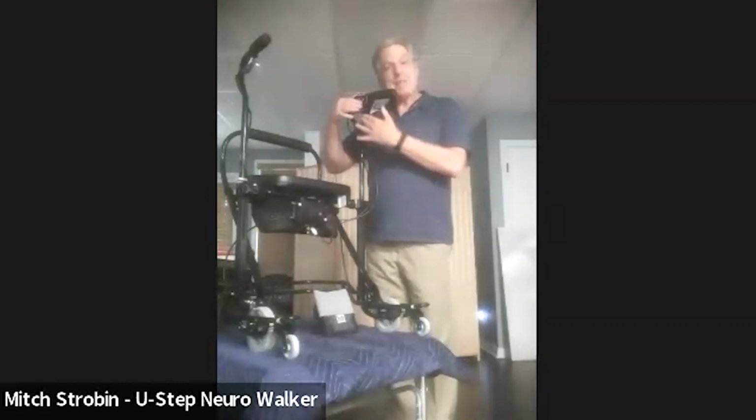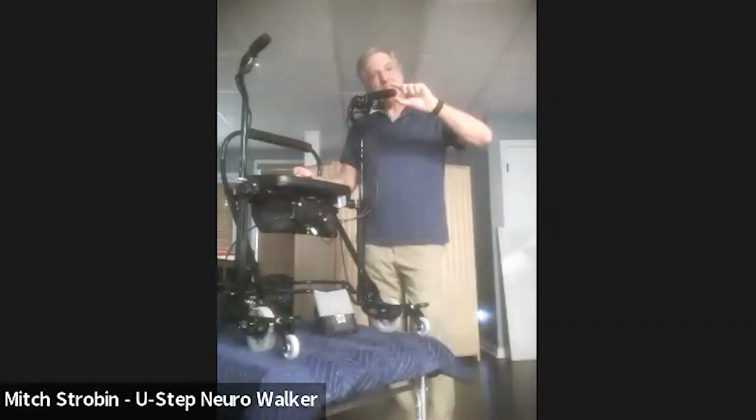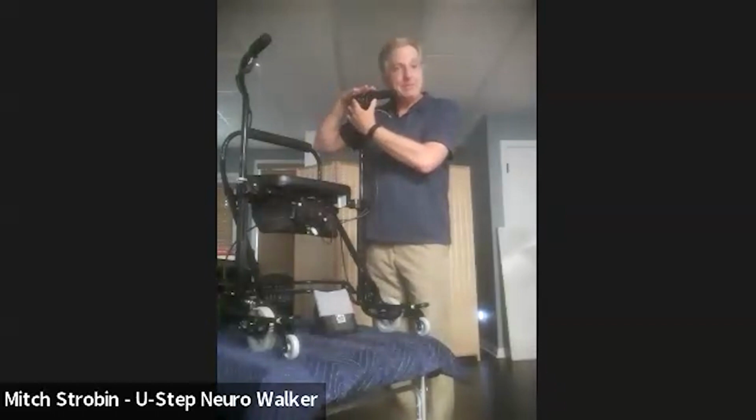Just to get technical, it ranges from 59 beats per minute, or about 1 per second, to 130 beats per minute, which is about 2 beats per second. Those 2 black buttons we had just talked about, when the metronome is on, you can increase or decrease the cadence. So they serve a different function. So once again, very simple. And once again, it's an option. If you don't need it, that's fine. You can always add it at a later date too, if you wish.